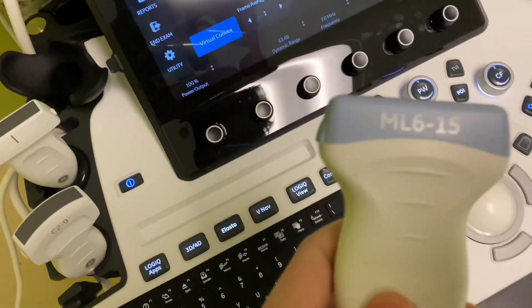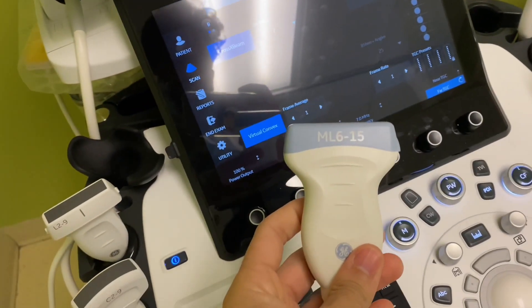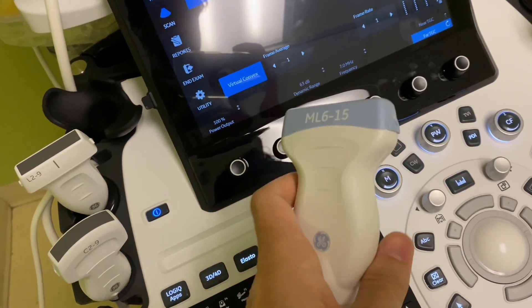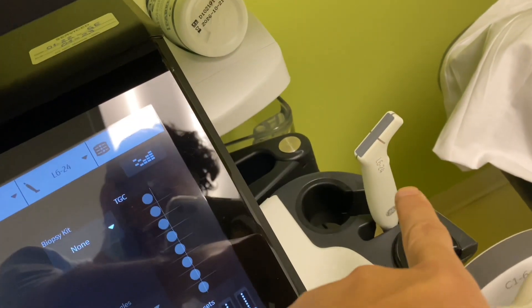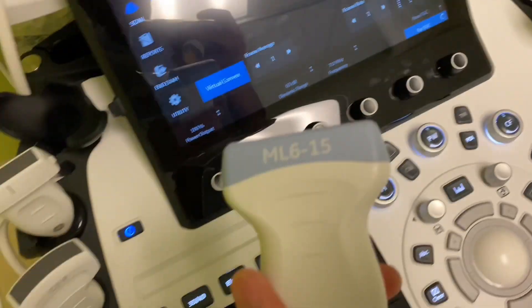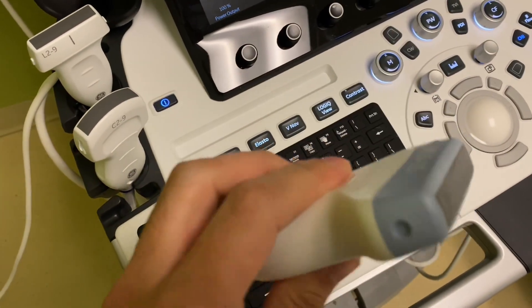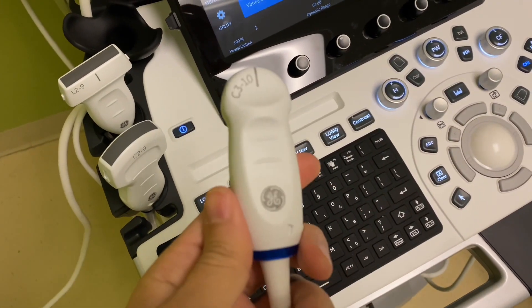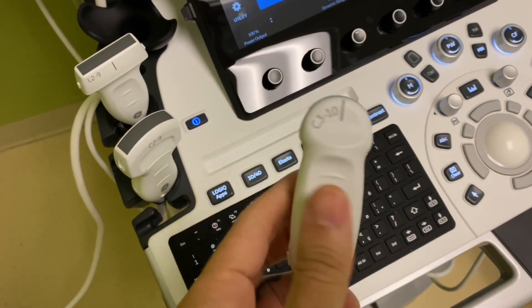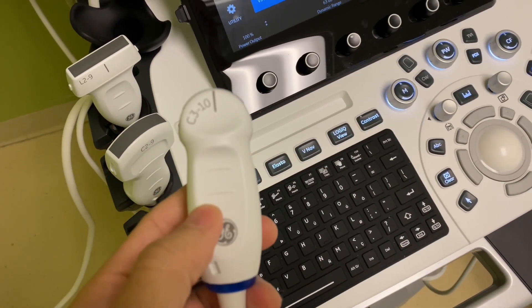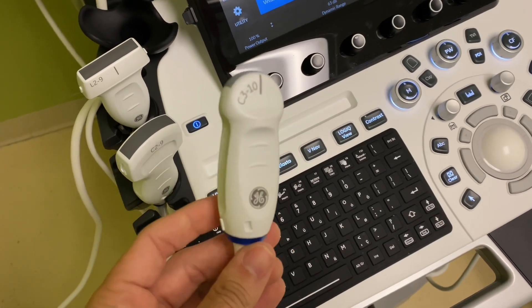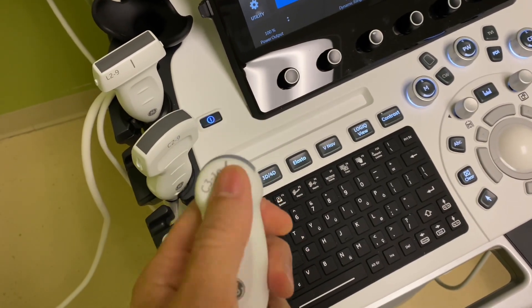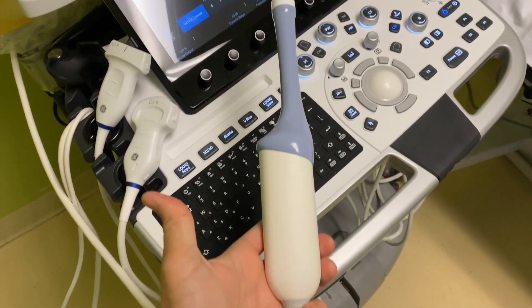All right, so more on transducers. You have the ML615, great for thyroids. You could also use it on appendixes if they're very thin, you want to get a nice picture. Same thing with this one. I use this on sometimes real small patients I have appendicitis, want to get nice pictures like the example I just showed. Thyroids, testicles, musculoskeletal. This one is also available in the other machines: C310, really good for baby brains, right? Also can be used for neonatal abdomens. It's very nice. You can use this for vascular and neonatal abdomens if you're doing like renal Dopplers and stuff like that. Beautiful. An endovaginal probe.